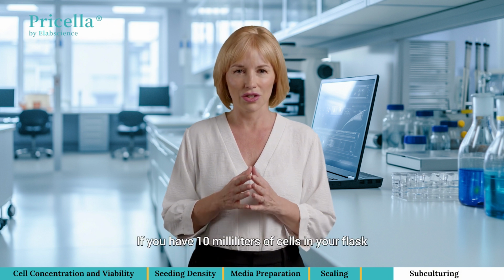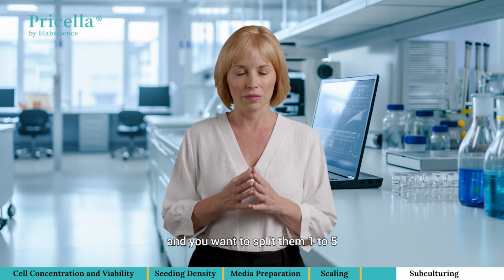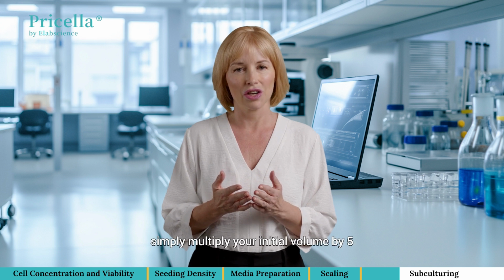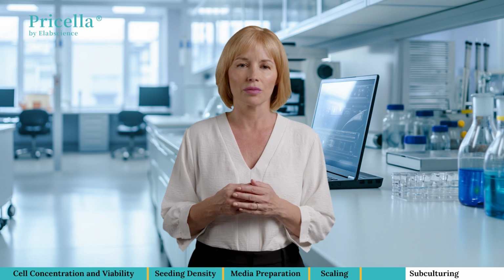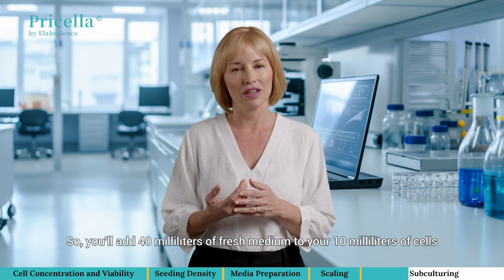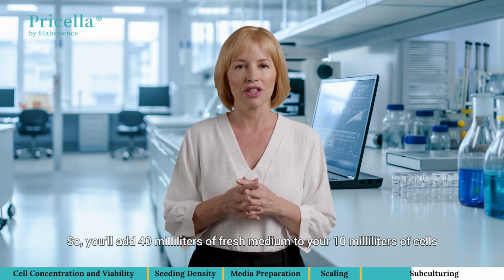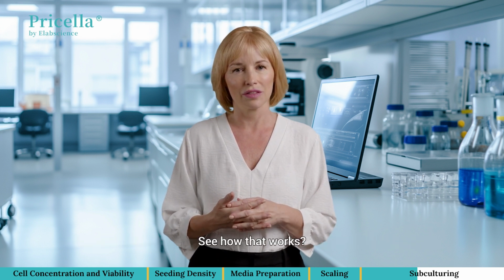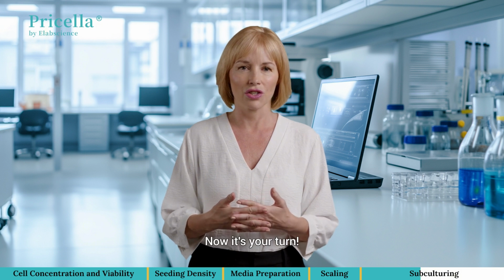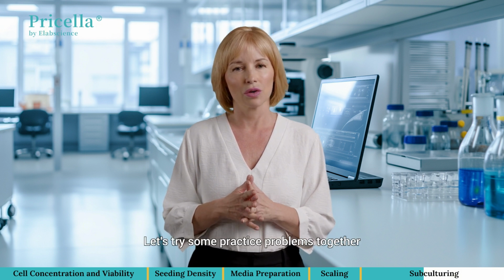If you have 10 milliliters of cells in your flask and you want to split them 1 to 5, simply multiply your initial volume by 5. This gives you 50 milliliters. So, you'll add 40 milliliters of fresh medium to your 10 milliliters of cells. That's it. You've split your cells 1 to 5. See how that works? Now, it's your turn. Let's try some practice problems together.